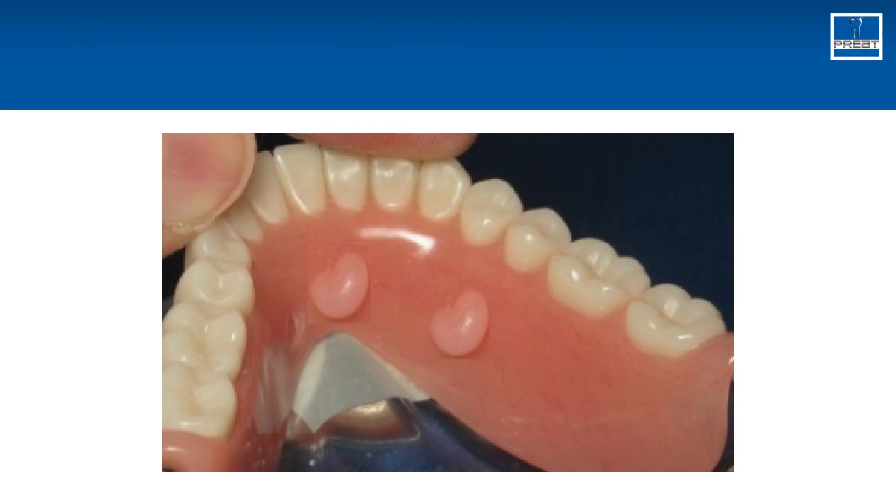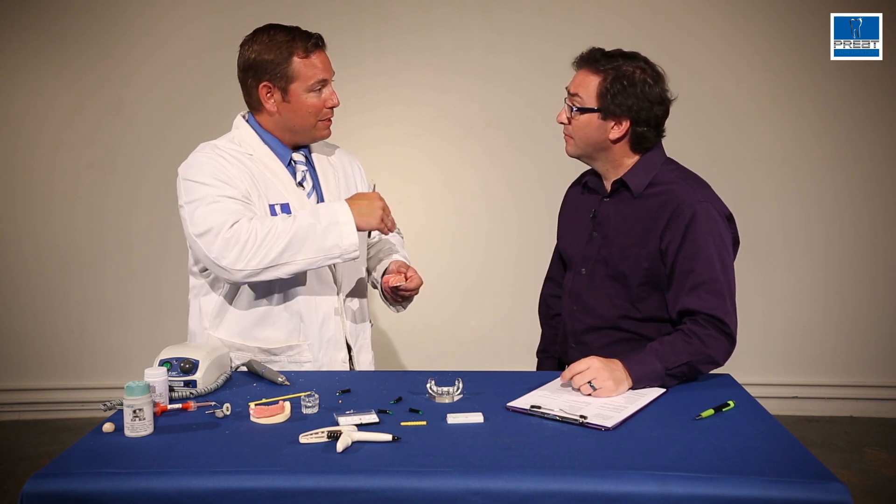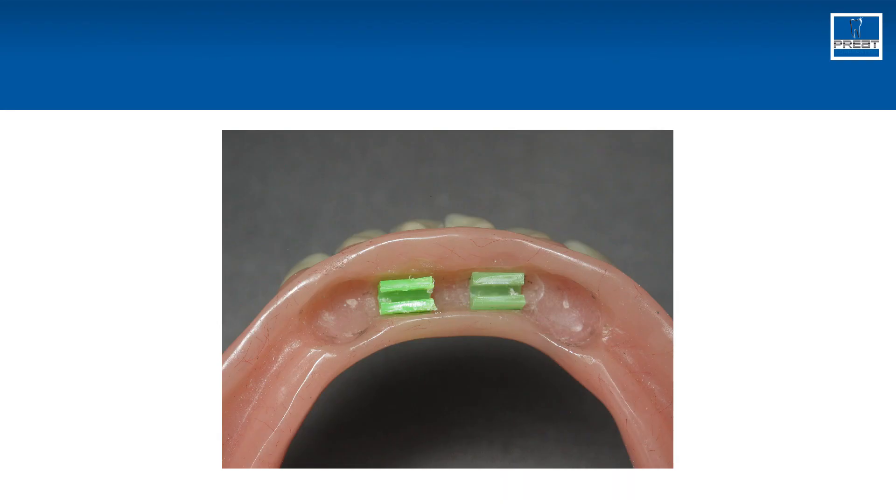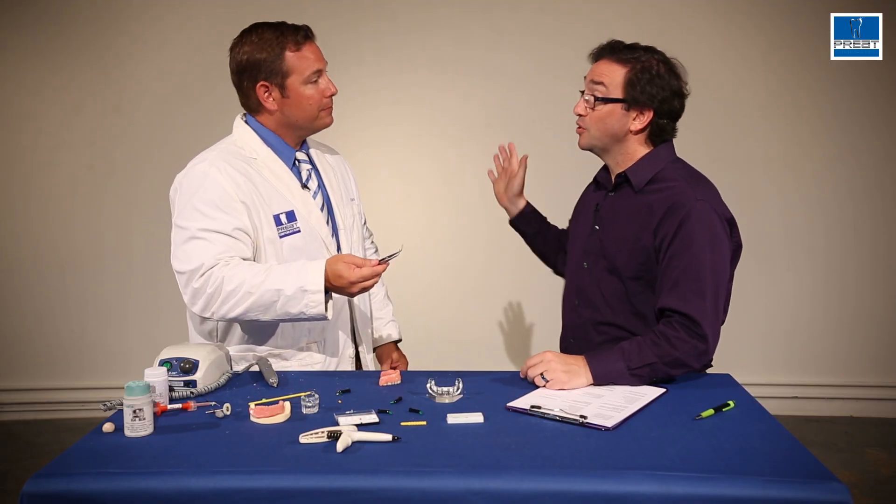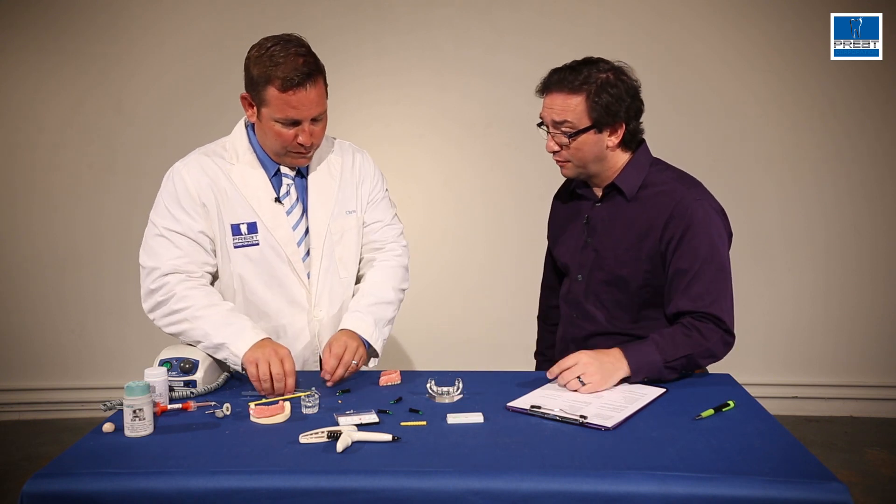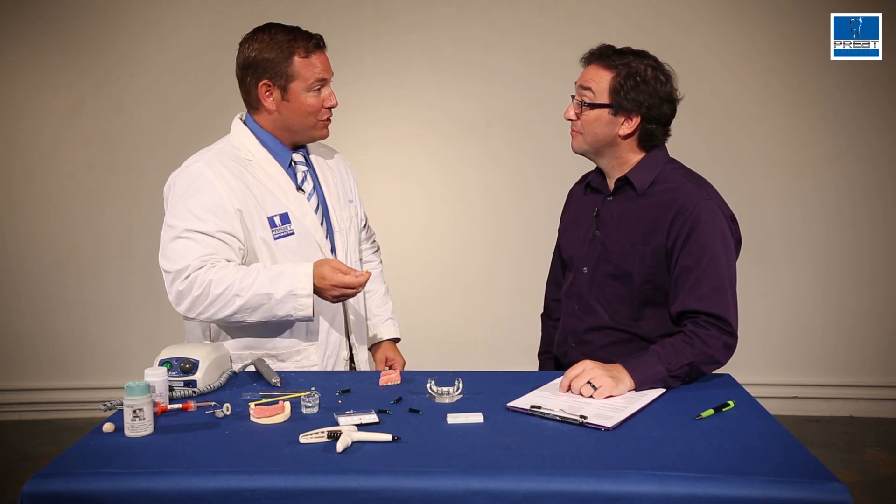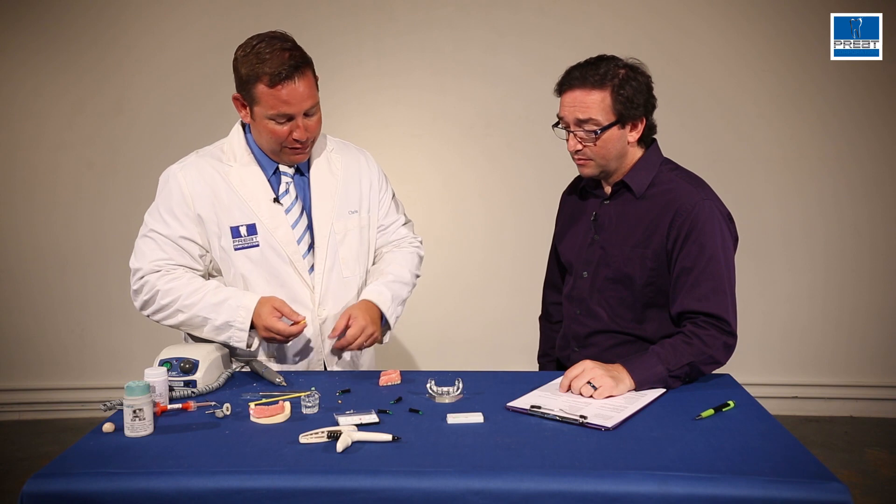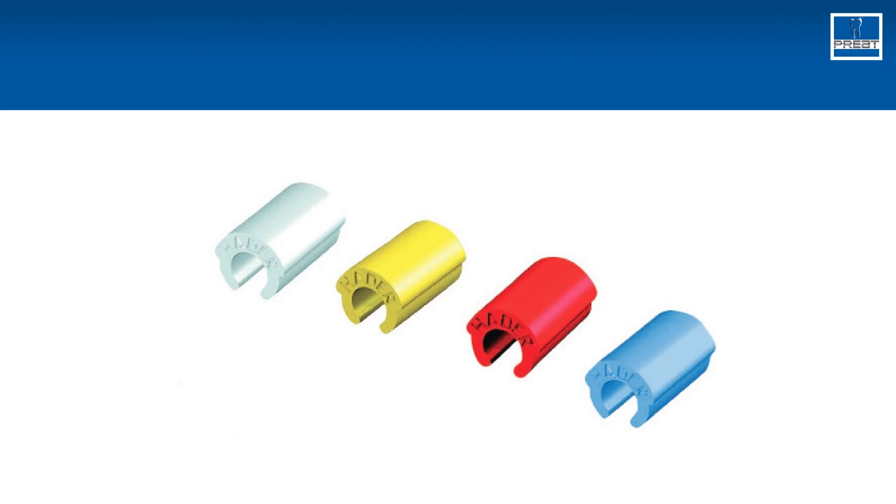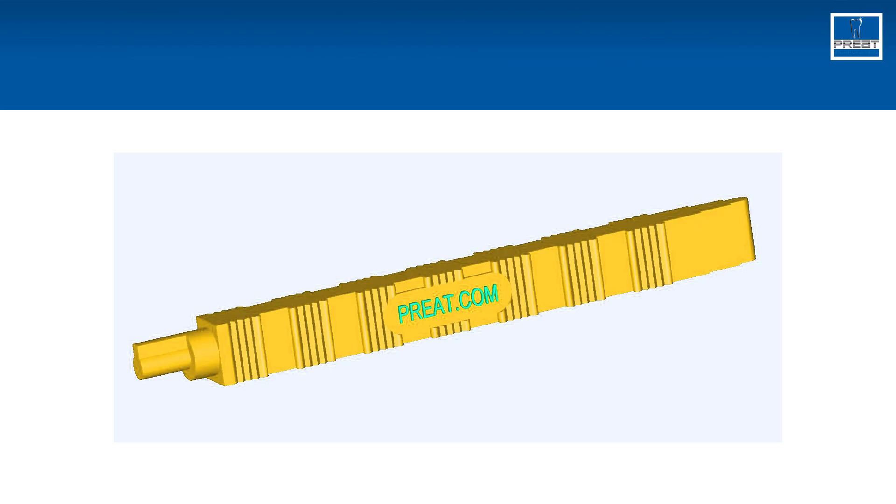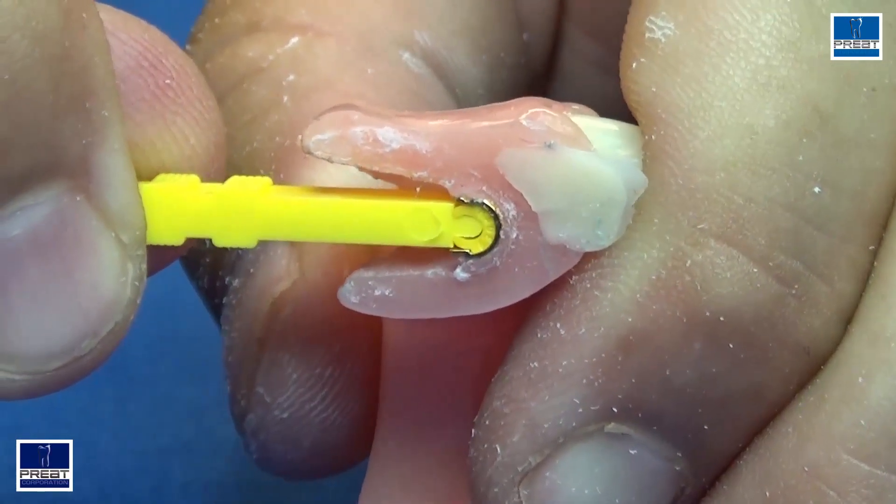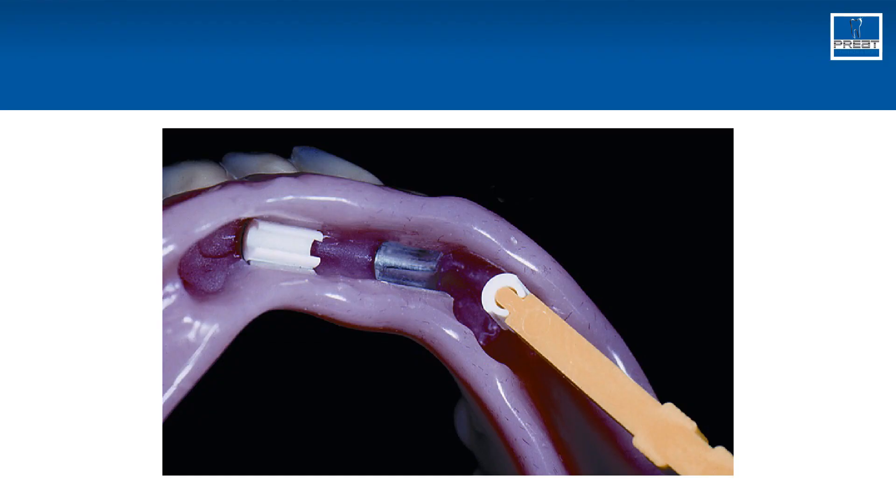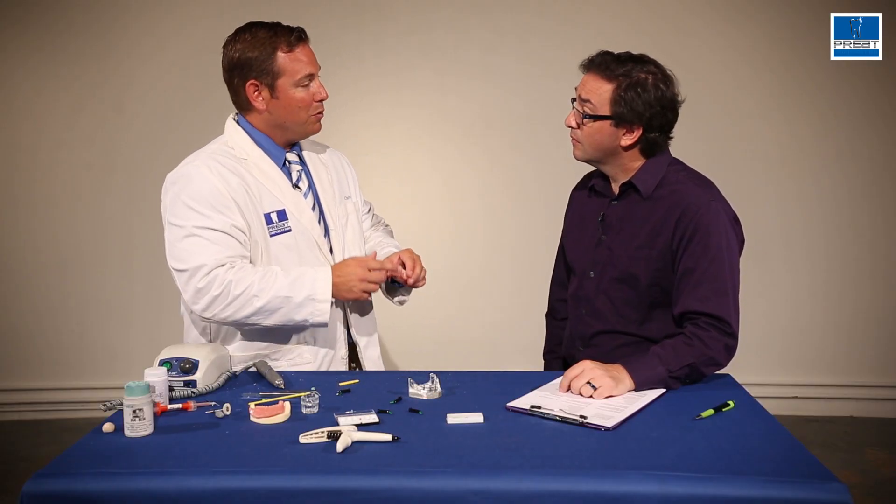All right Chris, what's the next step? You can see where the excess material started flowing out through here. We clean that up. The next thing we're going to do is we're going to remove that green processing clip. We can take a blade and make an incision down it and pull it out. Or if you have strong fingers, you can take a pair of pliers, tweezers, pull it right out like this. So that's the one that's the space holder that's going to be disposed of. Exactly. And you're going to replace it with one of those colored clips that we looked at before, the Hader bar clips. Correct. So when we take a look at the Hader bar clips, we're going to choose the retention that fits the patient's needs best. On a case like this where we have three Hader clips, I'm probably going to start off with the yellow one, standard retention. All I did here is I took the clip, I snapped it on the end of the insertion tool. I'm going to snap this clip into the metal housing we processed into the denture. Then at this point, the clip is in place. Try it back in the patient's mouth. We're going to come back, we're going to polish, remove any excess material, and we're done.